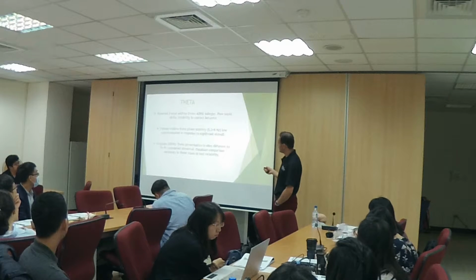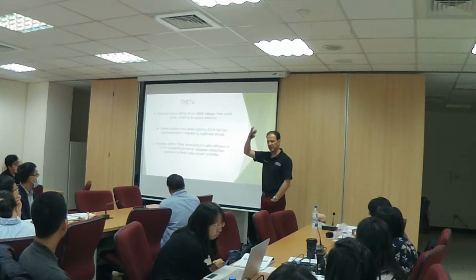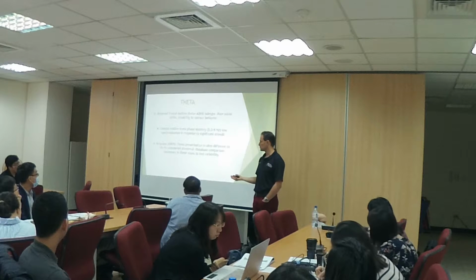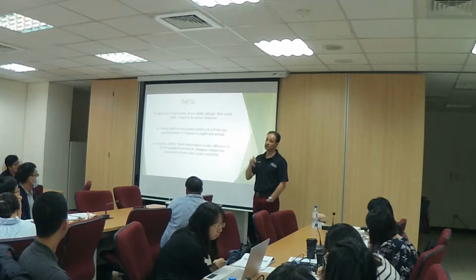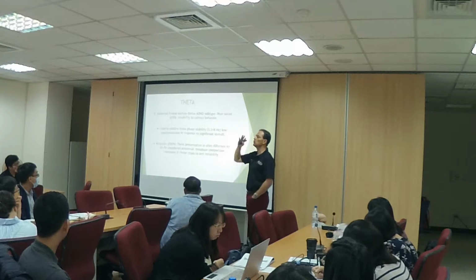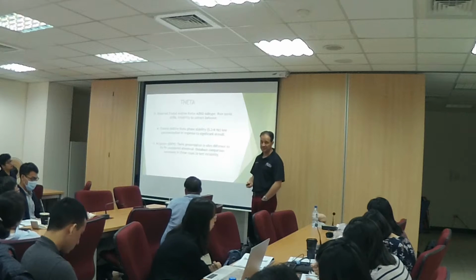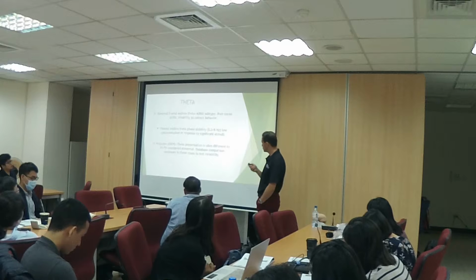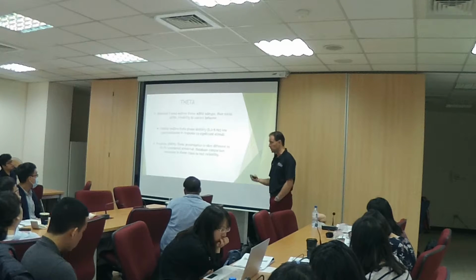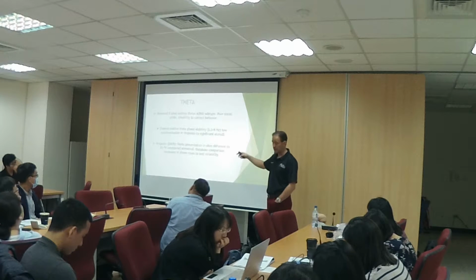So one of the subtypes is the theta rhythm. If you look at the EEG and you see the theta rhythm, and you look at FZ and CZ, that's one of the subtypes. But you can have frontal alpha or occipital alpha ADD. You can have mu rhythm ADD. You can have epileptiform activity type ADD. So it's really important to look at the brain. Do not go by the mere diagnosis of a book. Look at the neuronal substrates. It's very important that we look at the brain.